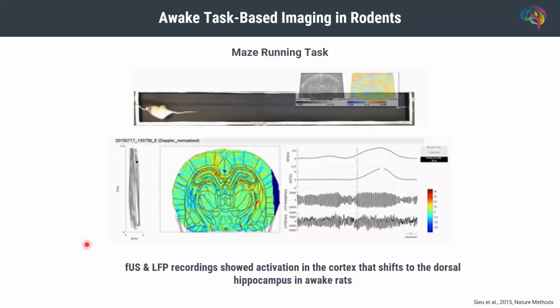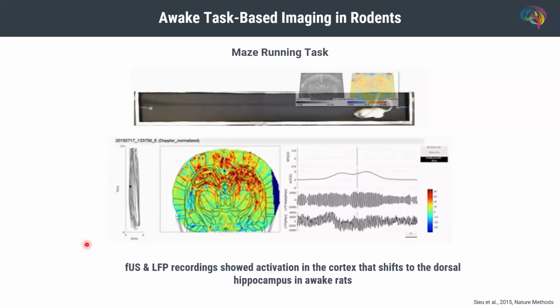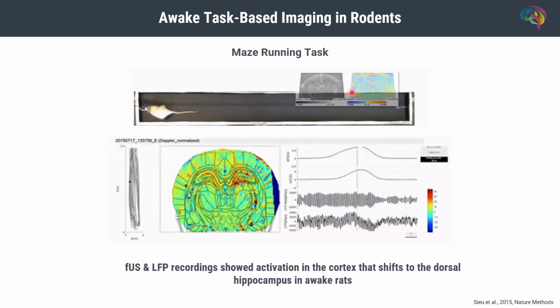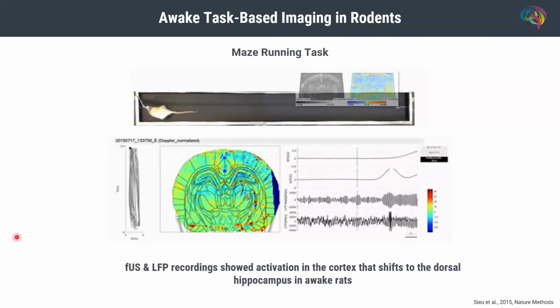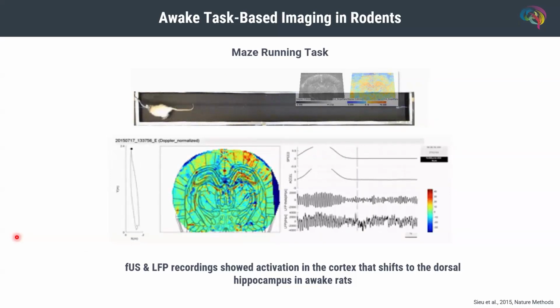And this, of course, happens coherently with the animals learning the task. So this publication proved functional ultrasound potential for awake imaging, including the possibility of combining it with other recording modalities like electrophysiology.